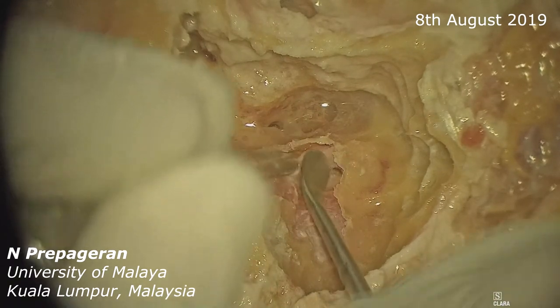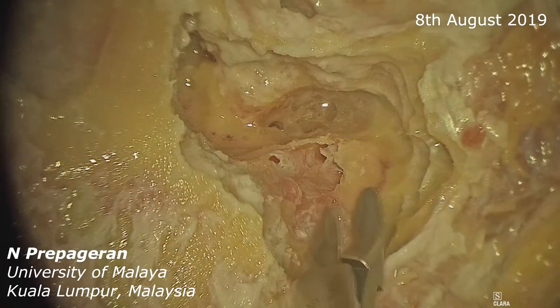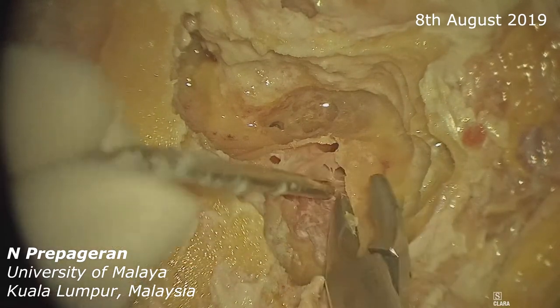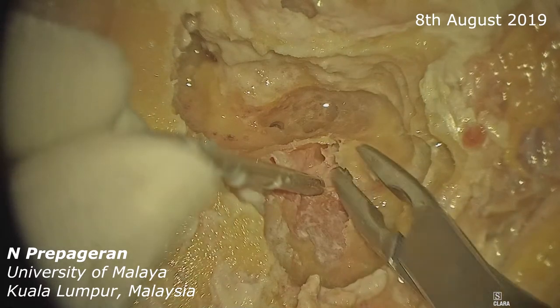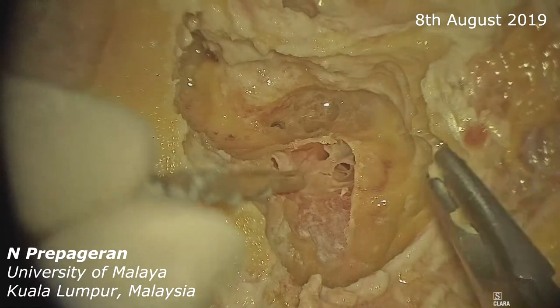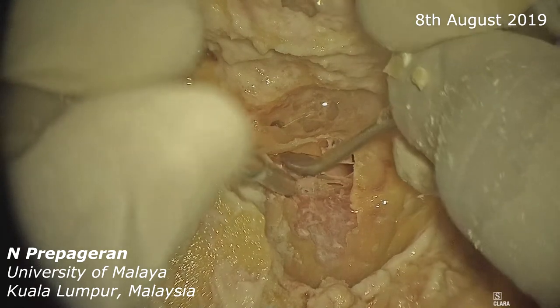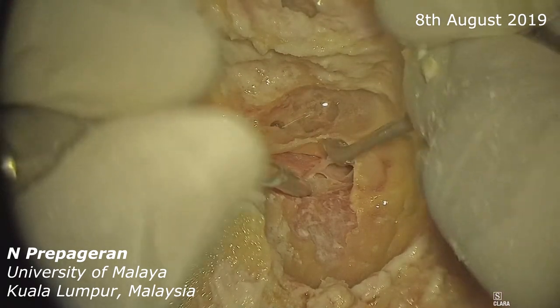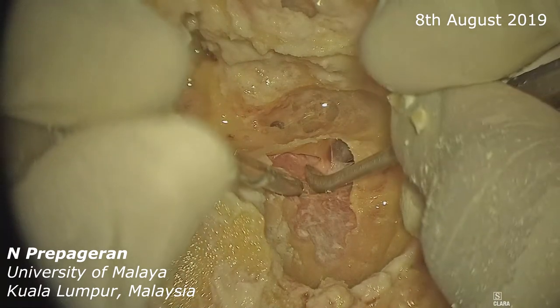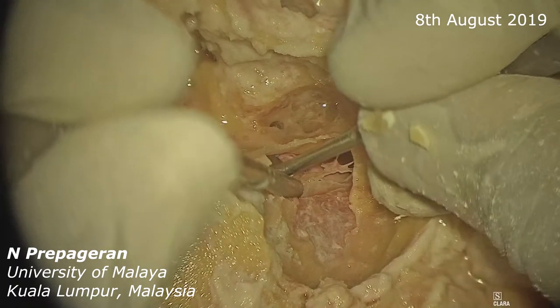So I'm trying to dissect the sigmoid sinus from the bone. What I'm doing here is exactly what I will do in real life. So once I'm able to push the sigmoid sinus down, I will use a bone nibbler just to nibble it away. Can you see how thin the sigmoid sinus is? That is the pre-sigmoid. Even doing the real surgery, this is exactly how I would do it. See how thin the sigmoid sinus wall is — it's paper thin. This is where the pre-sigmoid will come to.